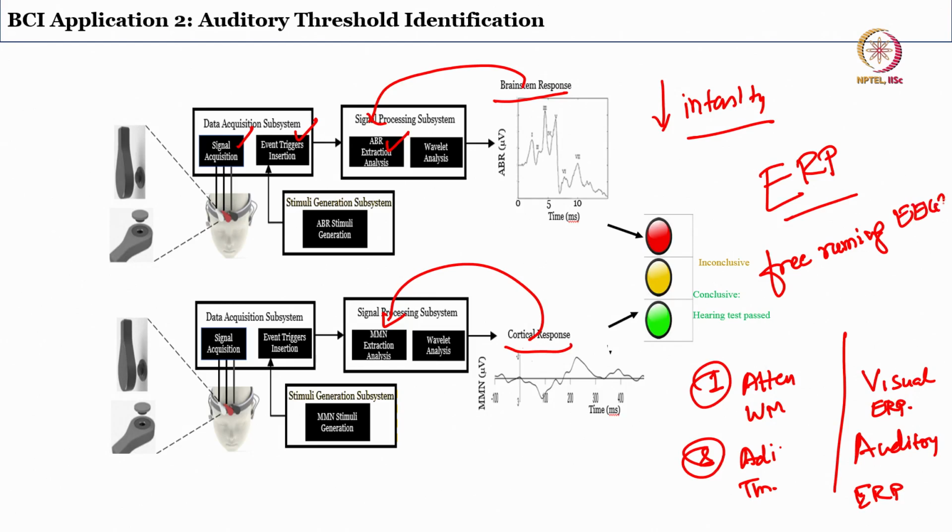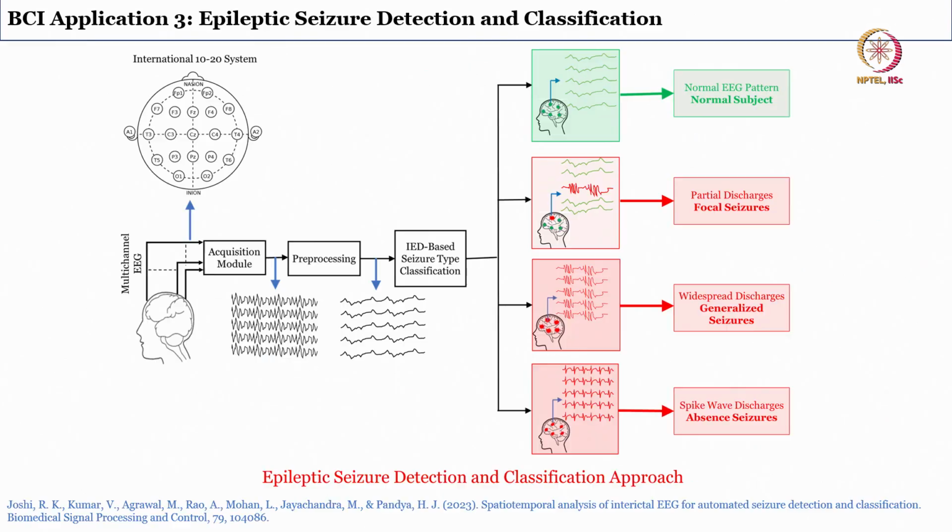Now what is free running EEG? Without any kind of stimuli or event, you are just recording EEG from multiple channels. Okay, does this thing convey any information? For that, let's see the next example, next application.